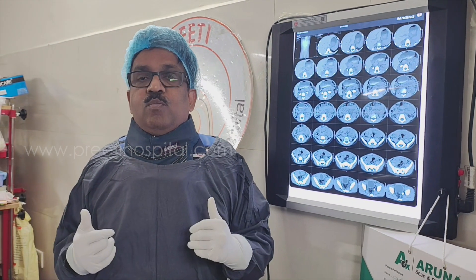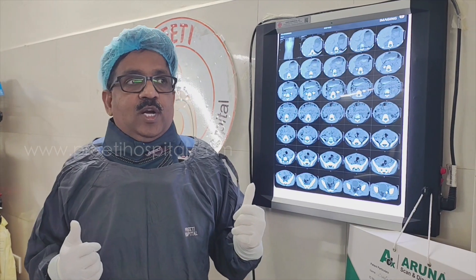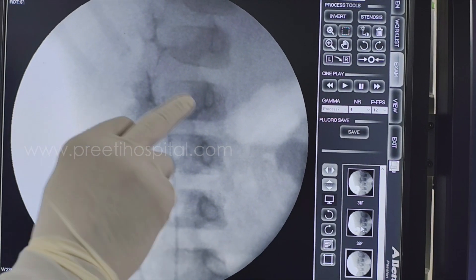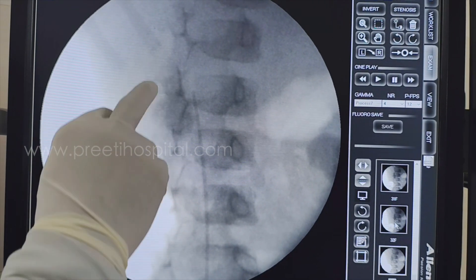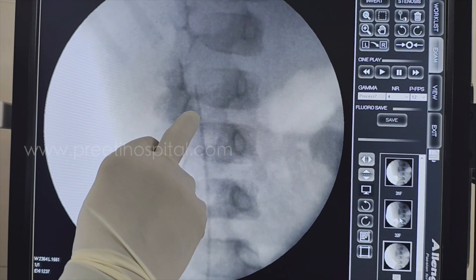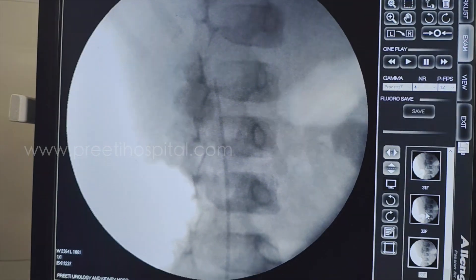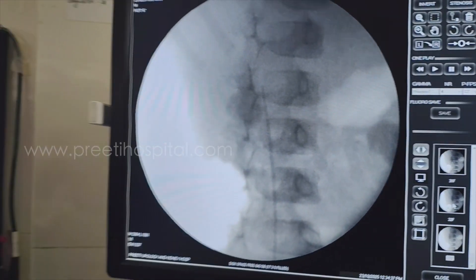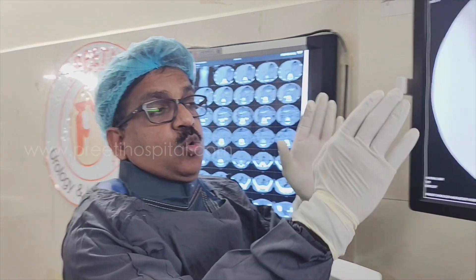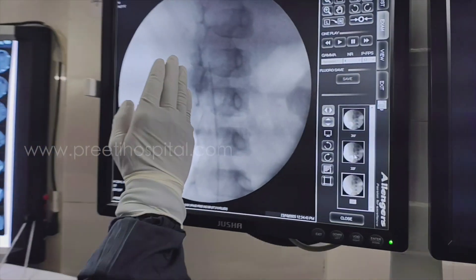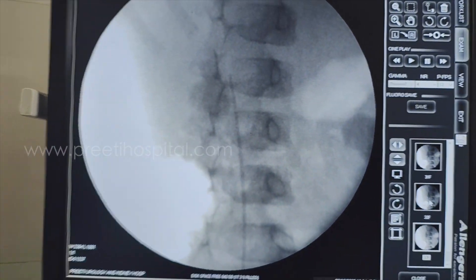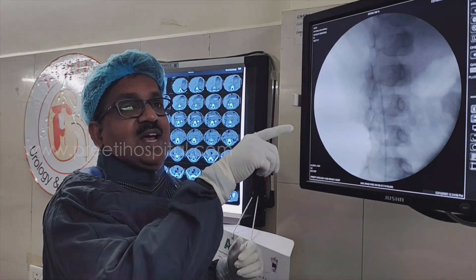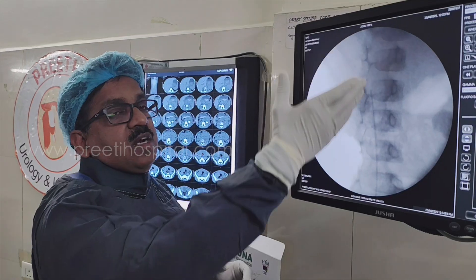Logically I thought, since I am doing both prone and supine due to large stone volume — if you see in supine position, this stone is falling on the spine. If you are not very careful, you don't know which is the transverse process, which is the stone, and where it is falling. The ureteric catheter is literally on the spine. This is the true disadvantage of supine cases. More you turn the patient in supine, more the catheter goes medially, making the case more difficult, with angulation problems.